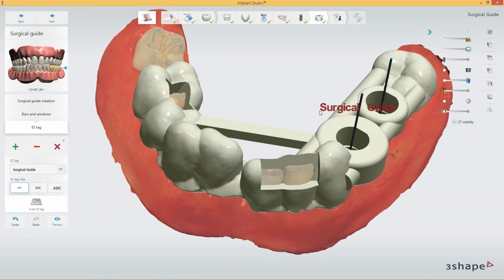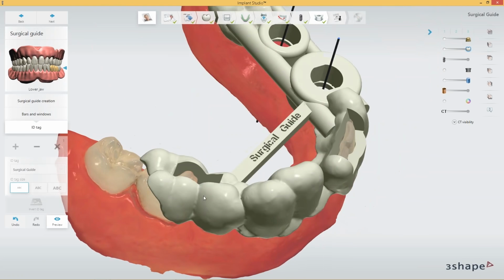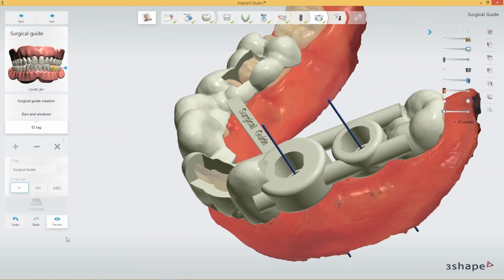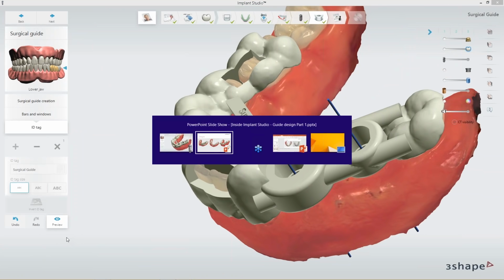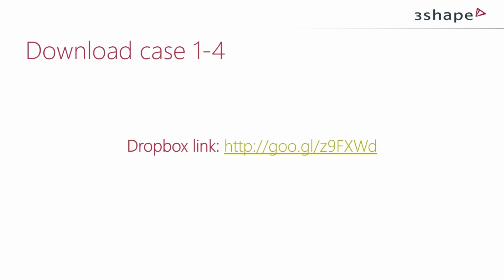So now I think we're also coming to the point where we have covered the main theme of the webinar today. It was mainly about giving everyone an idea of how to use the different guide design options we have made available in the software. We can only encourage you to use this and to play around, but also to test it with your fellow customers, dentists and surgeons. I'd like to stop here for today. It was really great to have you here, Jan. As I said previously, it was an inspiration and helped us understand what can be done, but also why it should be done one way or the other.